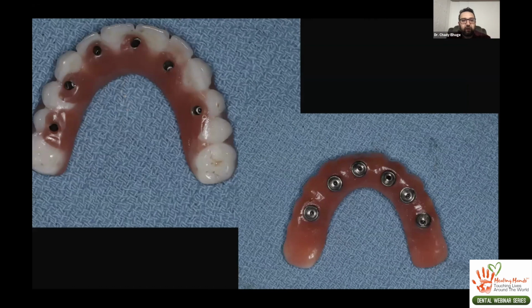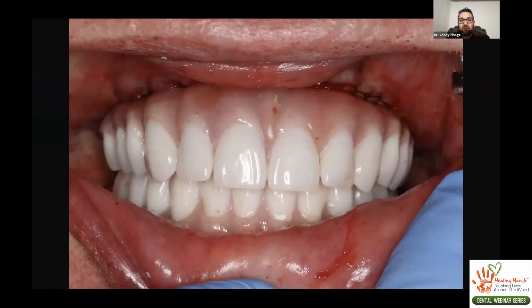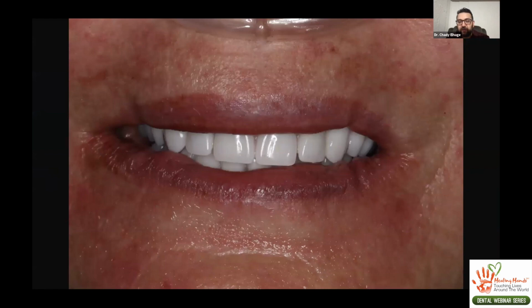You can see the old prosthesis, or I like this photo because it shows you the old permanent final restoration versus our new one. And you can notice some significant differences. Although thicker and stronger, we always let the patient know the prosthesis is going to be very thick in the beginning because I don't want this thing to break immediately after implants are placed. Same thing is done on the lower. That's how the patient leaves. And we always see them 48 hours after.